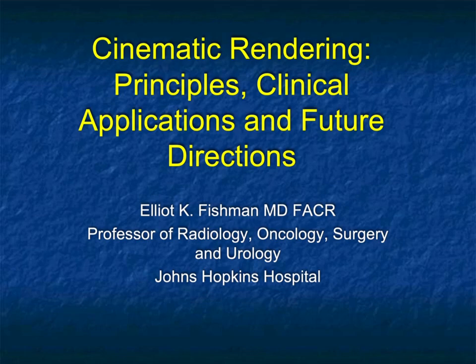And this is going to be a multiple part look at cinematic rendering, looking at some of the basic principles, focusing on clinical applications, and speaking a bit about future directions.